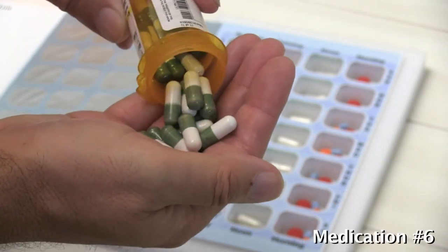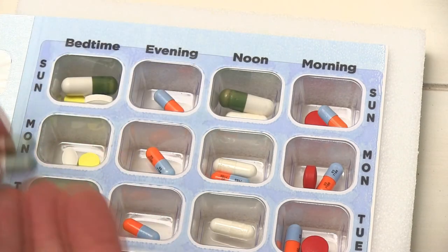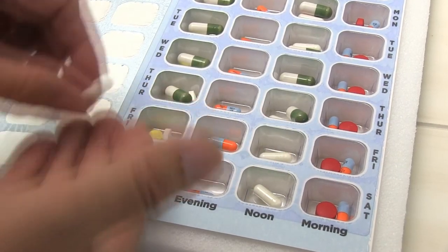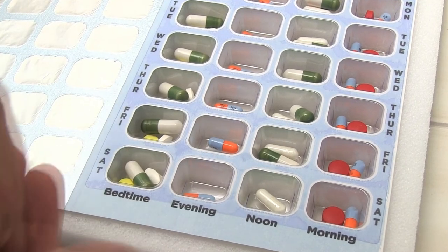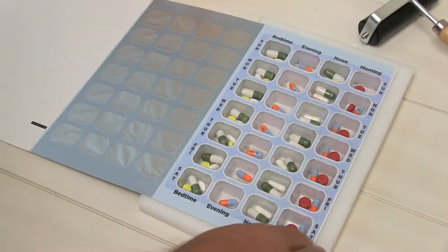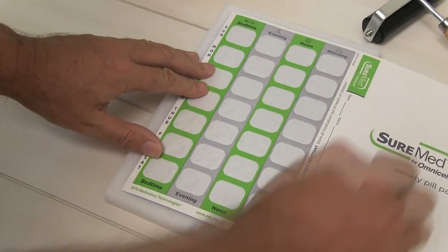Our sixth medication is taken at bedtime and at noon. Once filled, fold the card over and use the roller to securely seal the card.